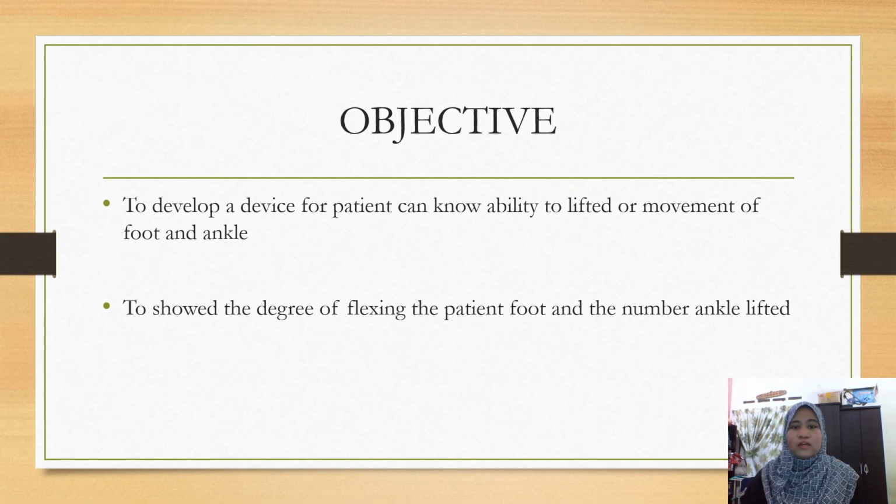Okay, after that, there are 2 objectives I've stated for this project. First, to develop a device for patients who cannot lift or move their foot and ankle. And second, to show the degree of flexing of the patient's foot and the number of times the ankle is lifted.